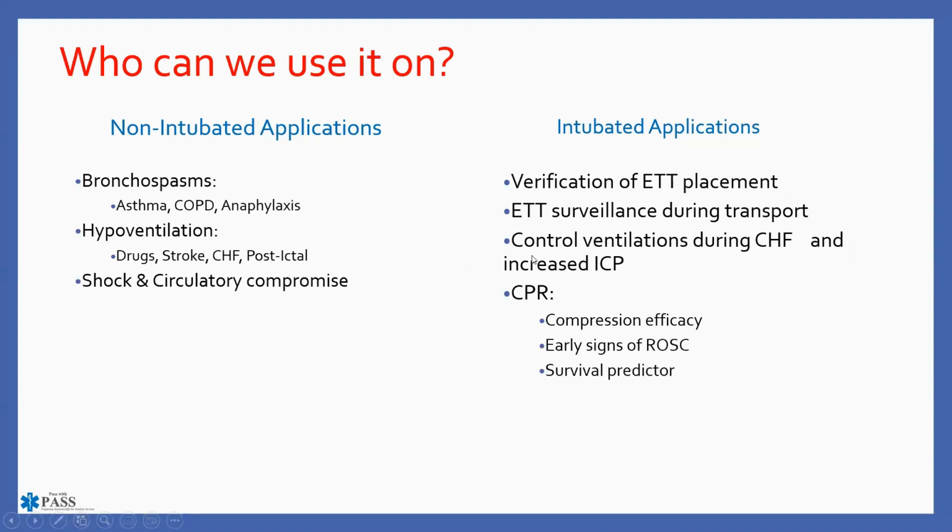Separate part here, control ventilations during CHF and increased intracranial pressure. And then if CPR is underway, then we can tell compression efficacy. We can tell if there are any times that ROSC is maintained or regained, and then as a survival predictor. So I want to talk about these just briefly.